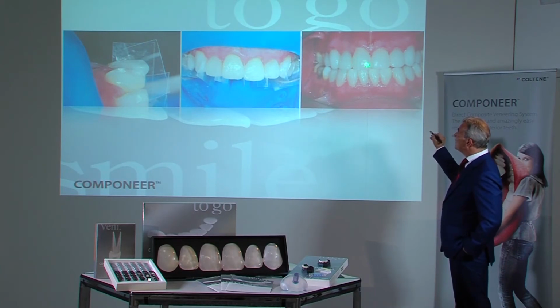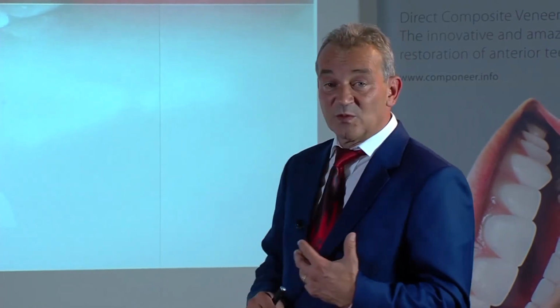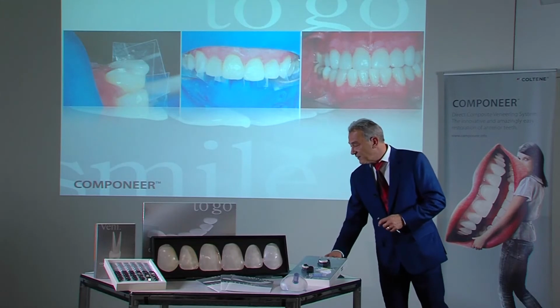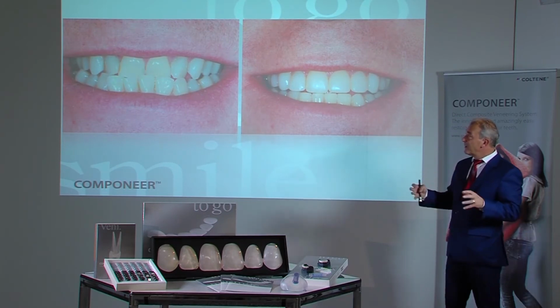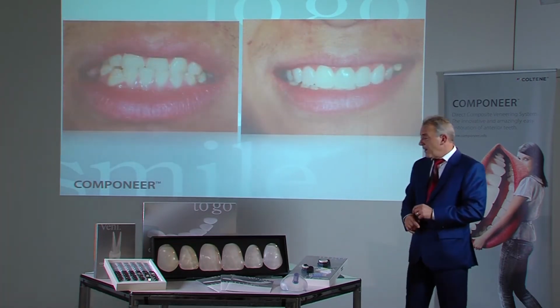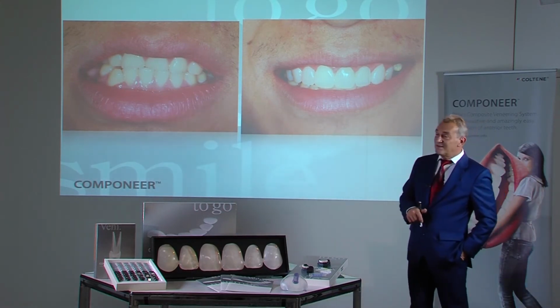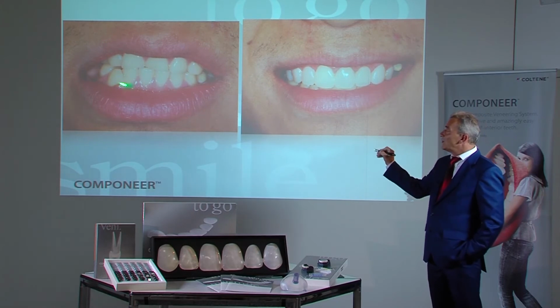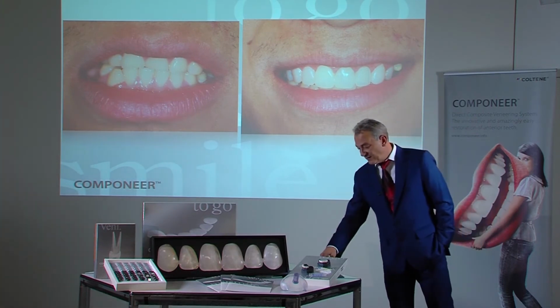As a final result, the maxilla is actually positioned above the mandible. As the patient does not suffer from bruxism, a special protective splint is also not required. Quite the contrary. The patient feels considerably more comfortable as there is no longer any interference of the jaws during biting. In other words, where orthodontic treatment is no longer possible, or where conventional systems fail, a new indication can be created or the situation improved by using composite and componeer.